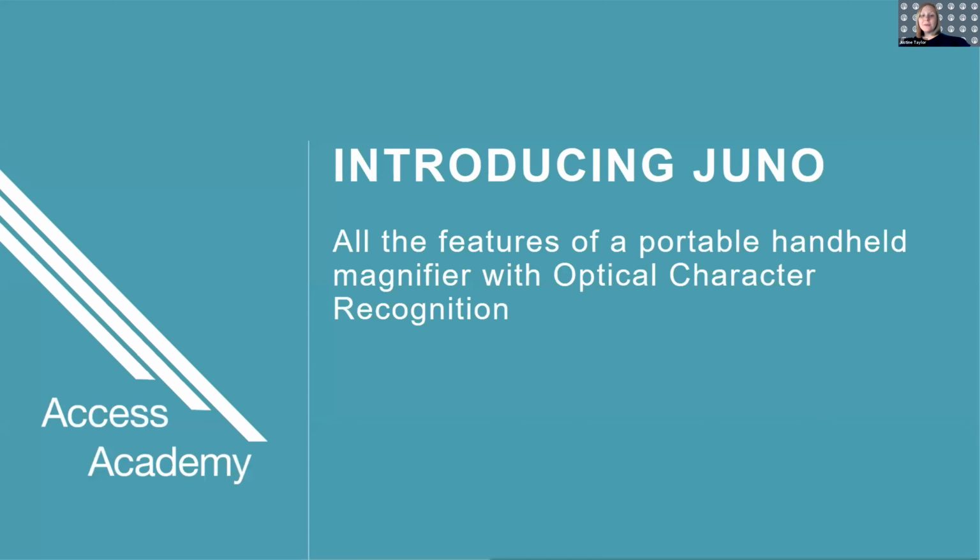All right. Hi, everyone. We are introducing the Juno today, and it is a handheld video magnifier, and it has all of the features of a portable handheld with optical character recognition. That is one of the main features of Juno. You can use OCR with a handheld. Moving on to the next slide, we'll talk about some of the features.